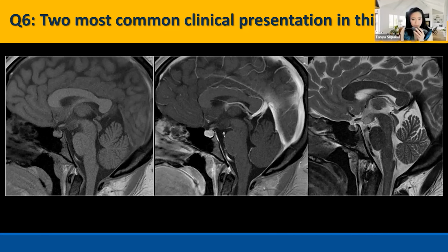Number 6. Who wants to take this one? The question is, the first step, you need to know what is the diagnosis based on this image, and then you will know what is the most common clinical presentation. I can take this one again. This is Paul. Yes, sure.